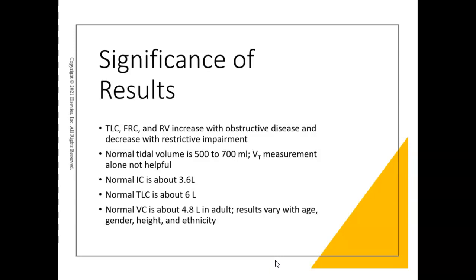If a patient is on home oxygen, it's very difficult for them to wear it when doing PFT testing because they're usually sitting in a box with nose clips on. So they're usually not wearing their oxygen anyway, but at least 10 minutes before the test, you would want to make sure that they're off of it. And if you're doing the sequence of testing like I typically do, where I'm giving my bronchodilator and then doing DLCO testing, I want to make sure I'm doing that with room air, not with oxygen.